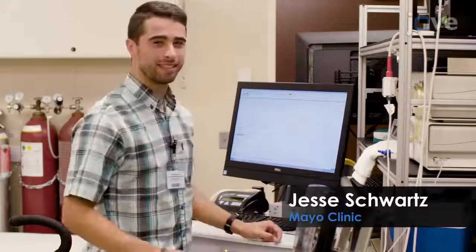Demonstrating the procedure will be Jesse Schwartz, a technician in the Cardiopulmonary and Performance Laboratory.